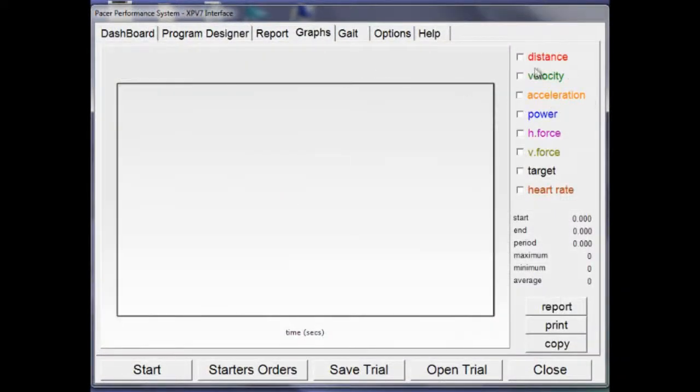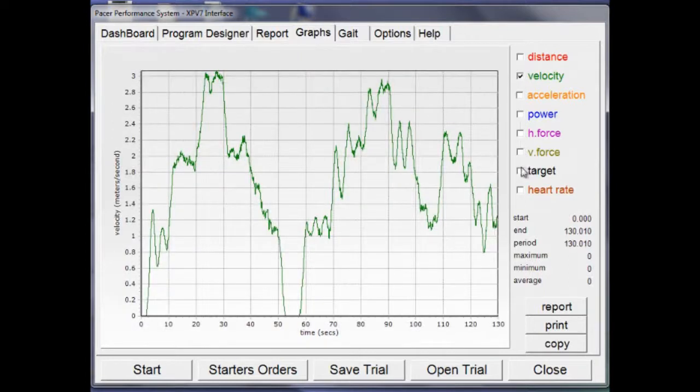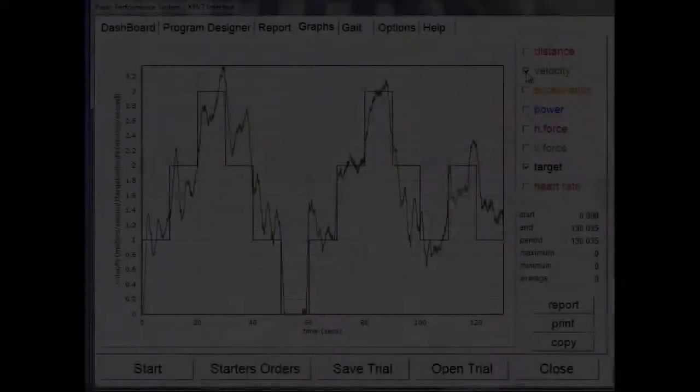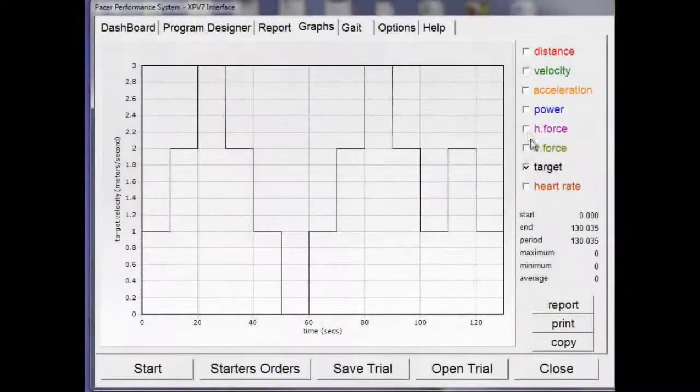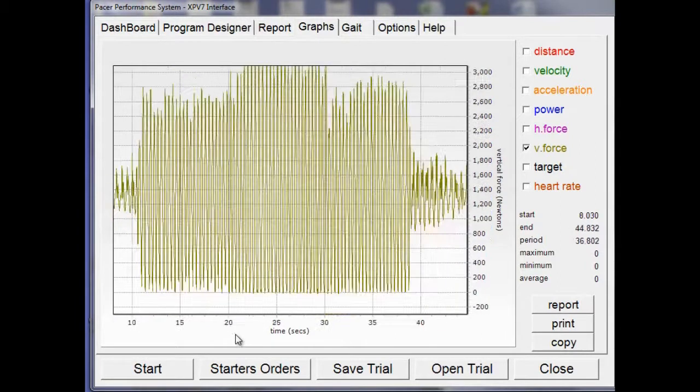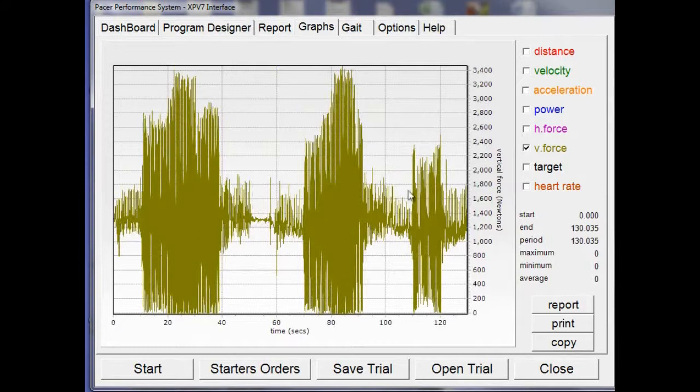And then you can go in and look at the graphs. So if we click on velocity and target you can see how well they tracked the target velocity. You can click on vertical force and zoom into a portion of the graph by left clicking and dragging, and then zoom back out by left clicking and dragging in the other direction.